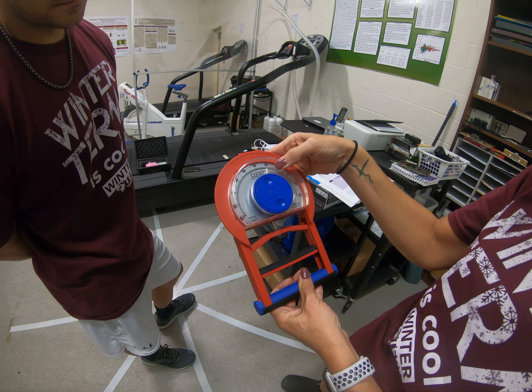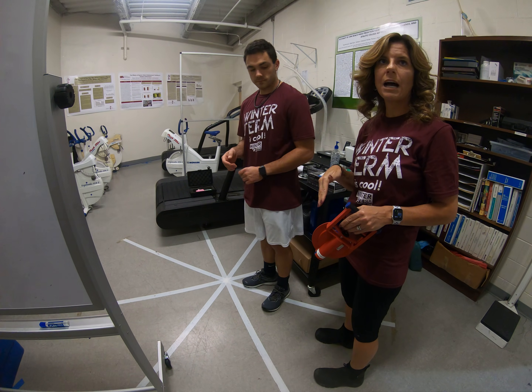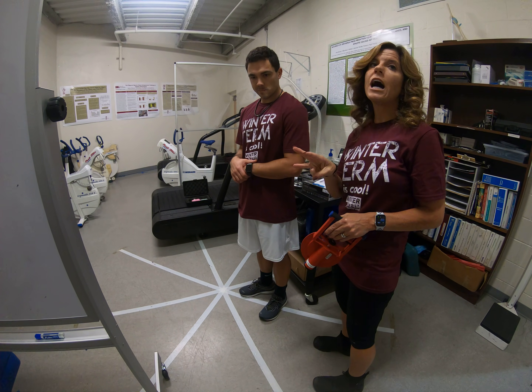So this would be 59 kilograms here. And then they will do the opposite hand the next time and you'll switch back and forth between hands three times.